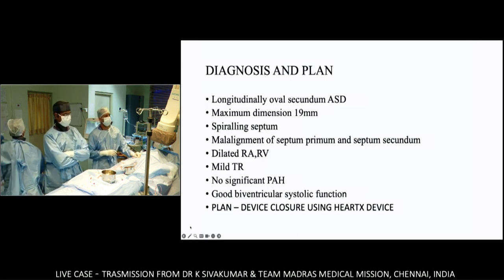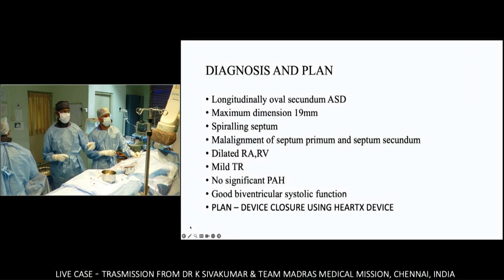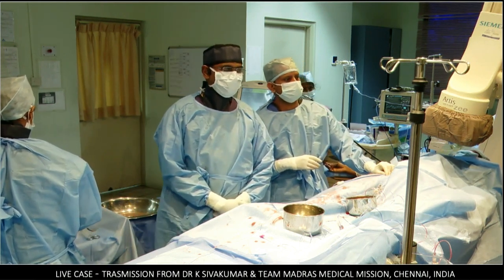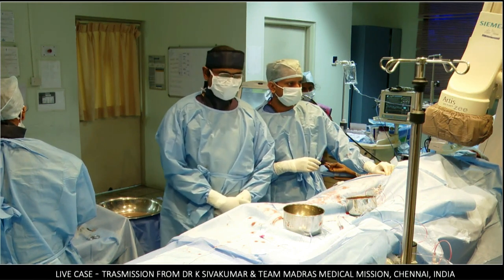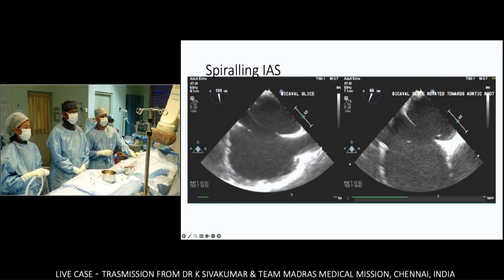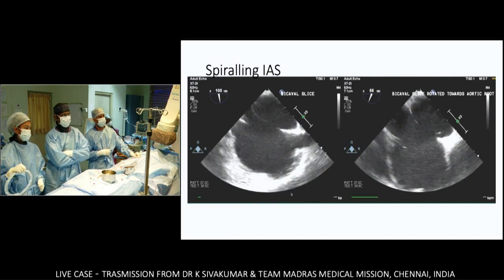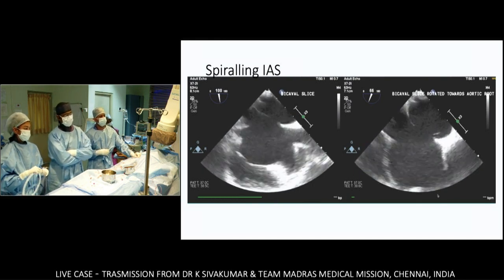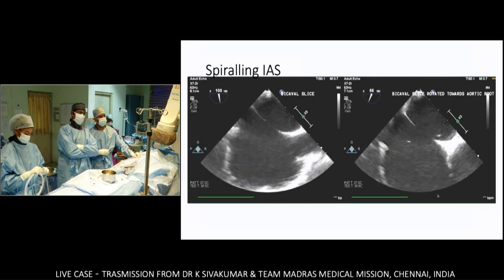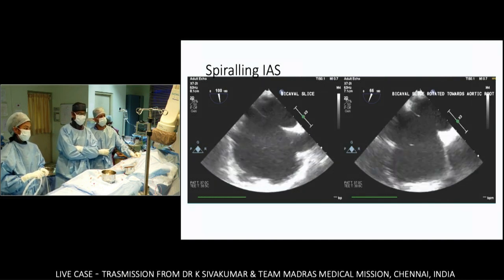The final dimension is a 19-millimeter ASD, longitudinally oval, with a spiraling septum and malalignment of the primum septum. There is RARV volume overload with mild TR and no significant pulmonary hypertension. The septum primum, coming from the inferior vena cava area, is slightly deviated more towards the left atrium, closer to the probe, whereas the limbus representing the septum secundum is slightly more towards the right atrium — mild malalignment.